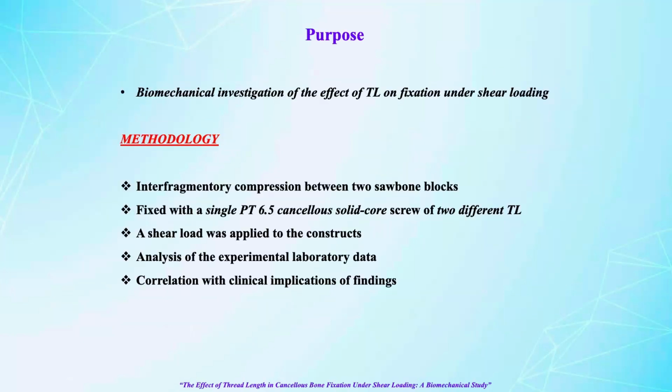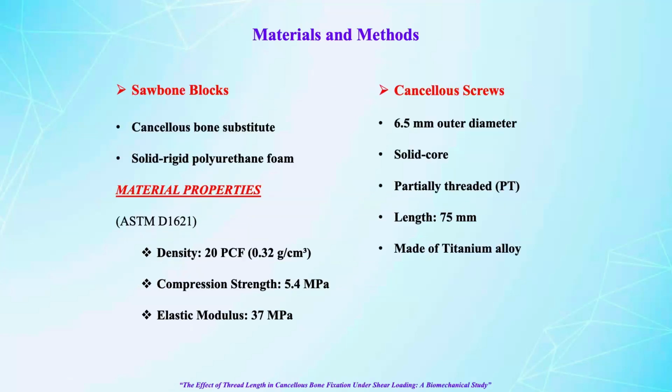Due to the fact that this is a relatively unexplored area of investigation, we decided to examine the effect of thread length on fixation under shear loading. The experimental laboratory data were then analyzed and correlated with the clinical implications of the findings.